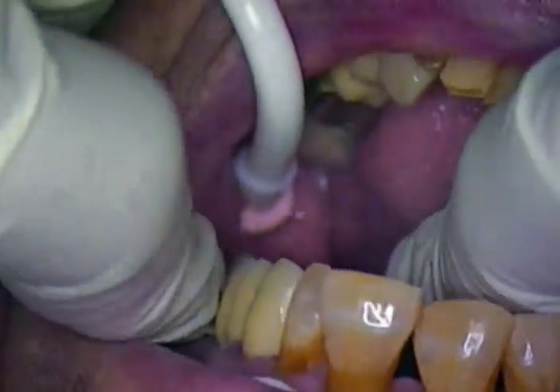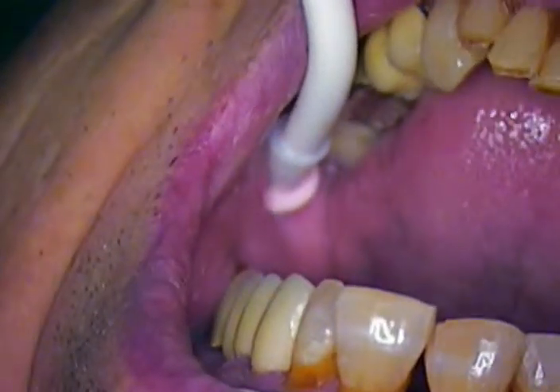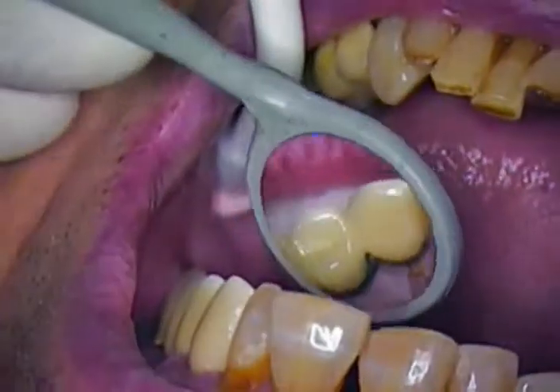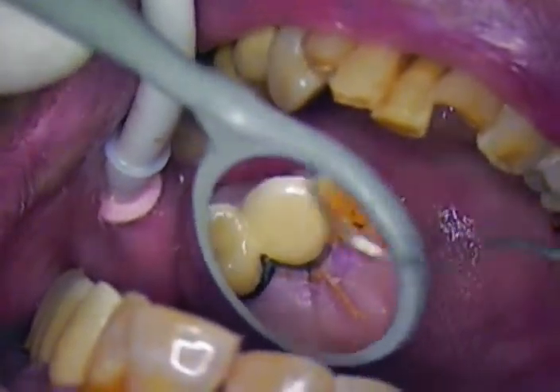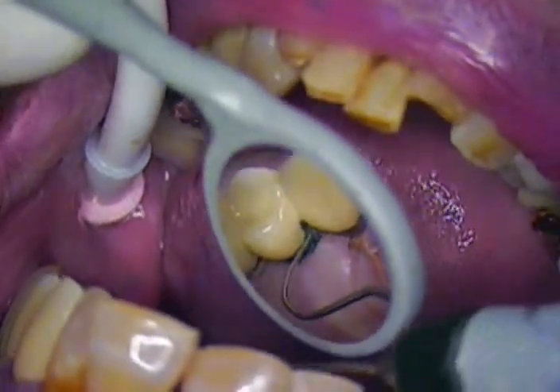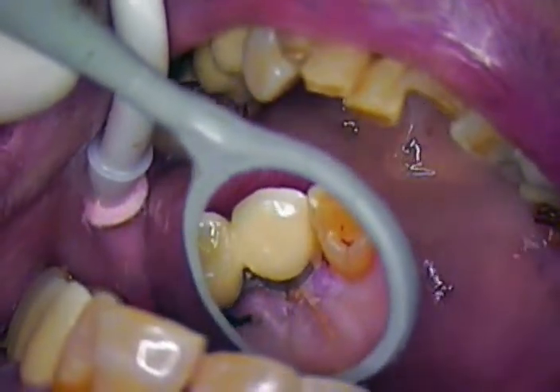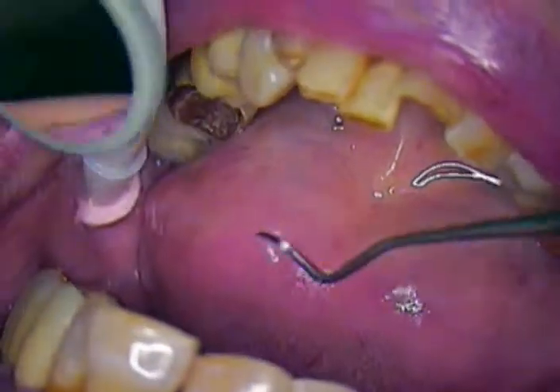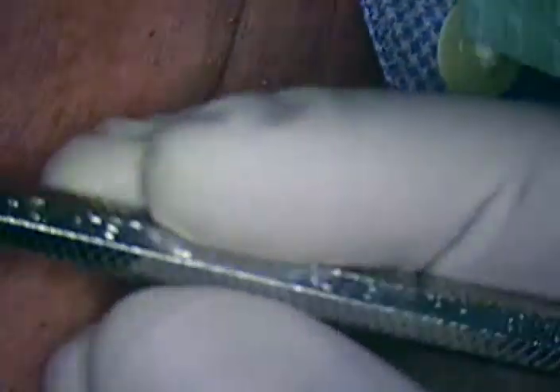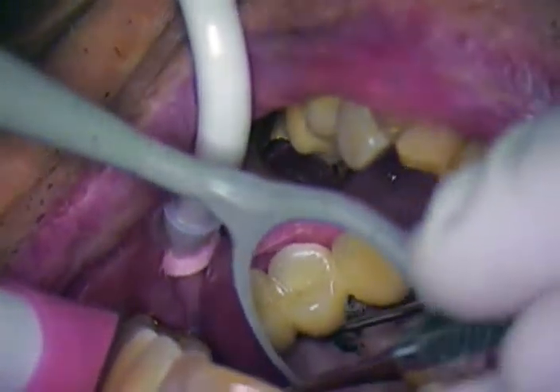Now we're sending it around the pontic region — you're going to feel a little bit underneath that tissue, that's the positive pressure that we have. Now I'm going to show you the lingual with the mirror. You'll see a couple of little pieces of string called siltrex, which as I explained in other videos acts as a preventative barrier. Now I'm going to use a scaler to remove some of that excess cement — a sickle scaler, specifically the HuFriedy 204S sickle scaler.